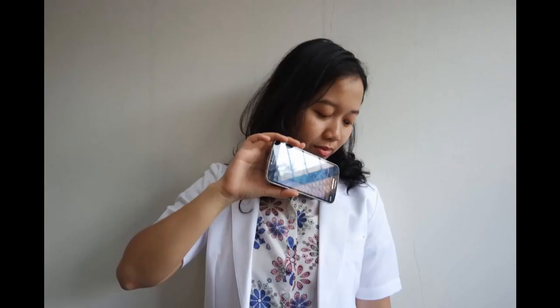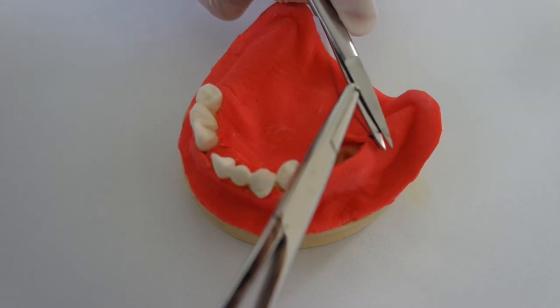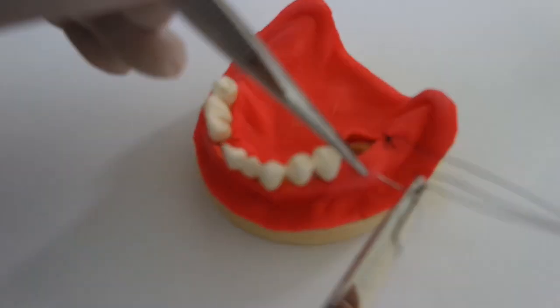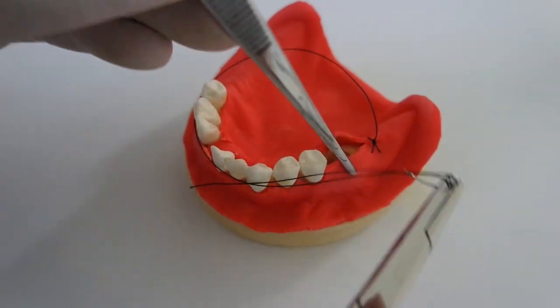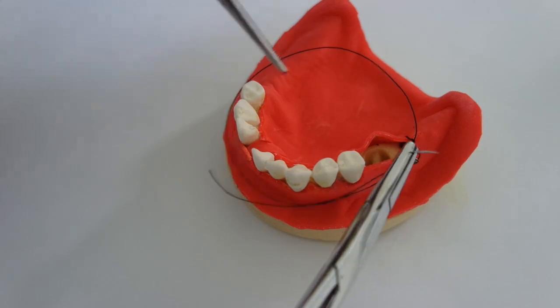Continuous interlocking suture. It is indicated for superficial long incisions, but if it breaks, the whole suture will be undone. Create an initial knot, cut off the free end of the suture. Use the needle-bearing suture to create successive continuous sutures. Pass the needle through a loop created before penetrating the tissue.